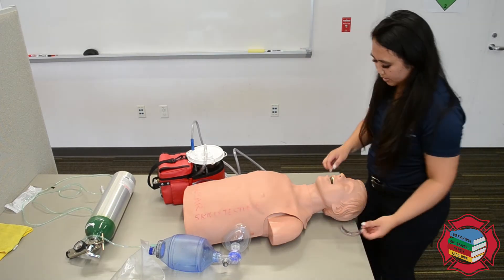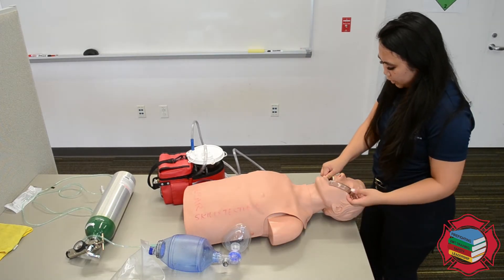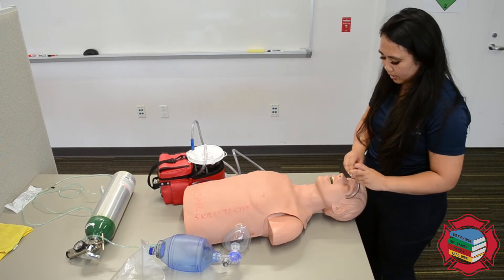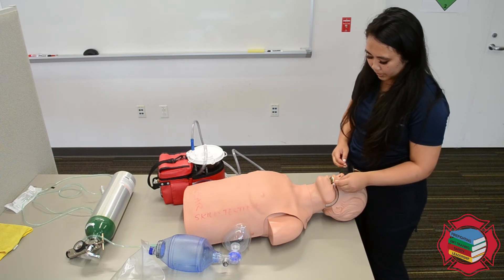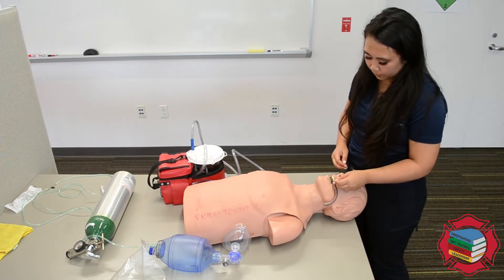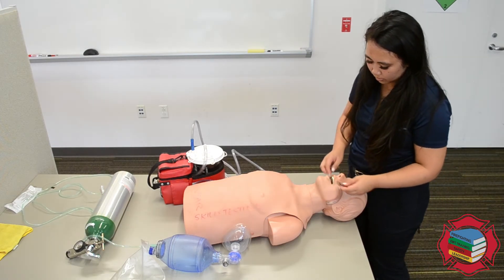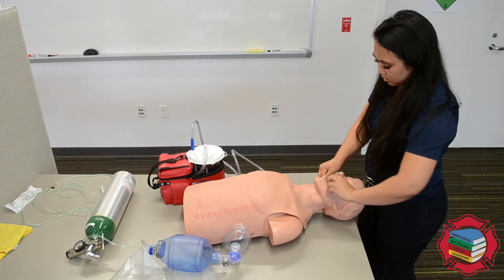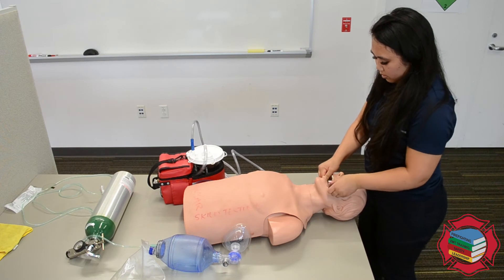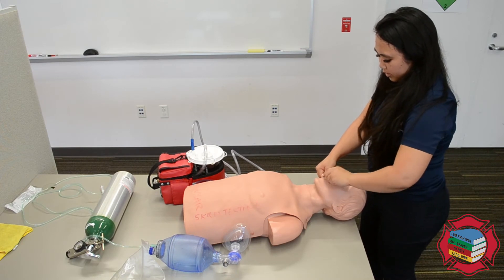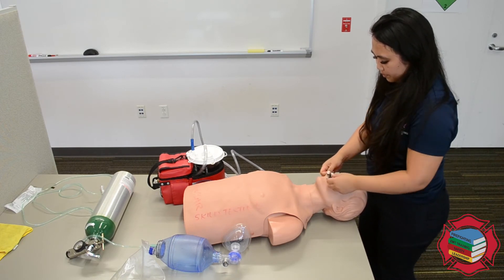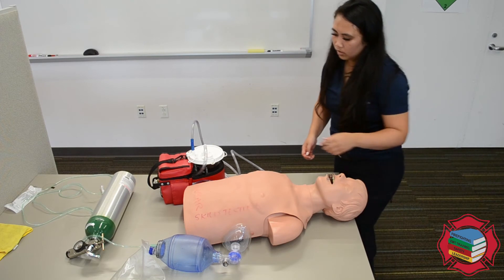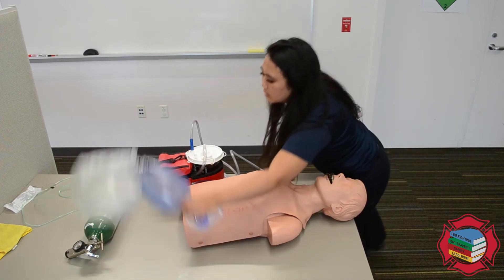I'm going to go ahead and secure my patient's airway using an OPA. I'm going to measure the OPA from the front teeth to the angle of the jaw. Rotate it ninety degrees. No gag reflex is present. The patient accepts the airway.